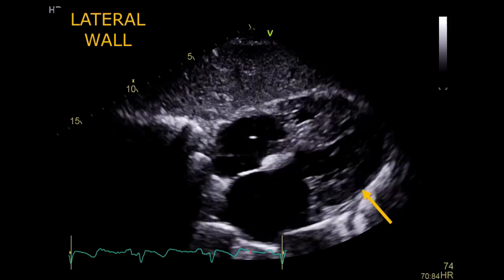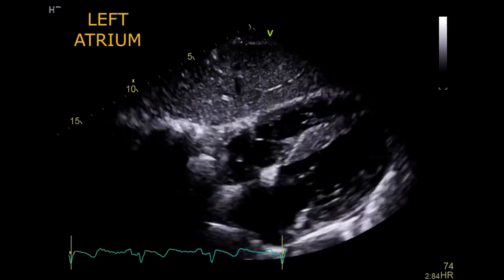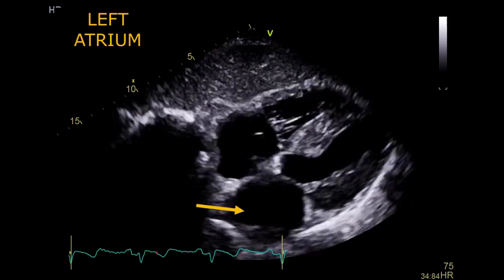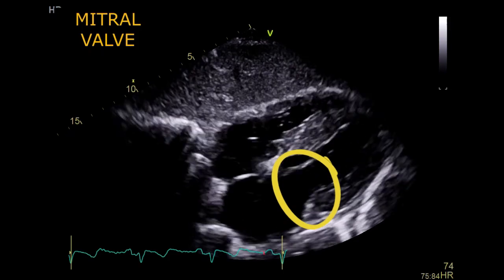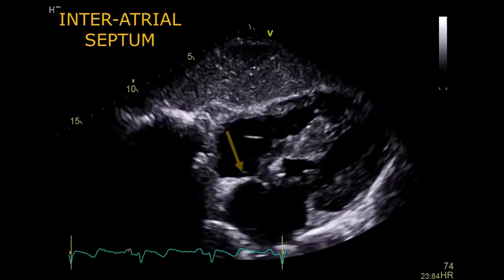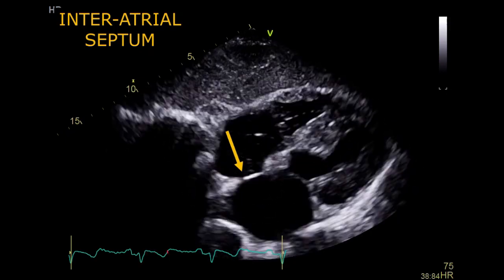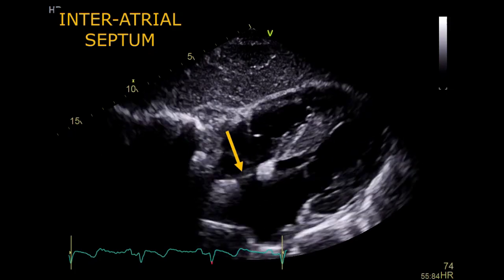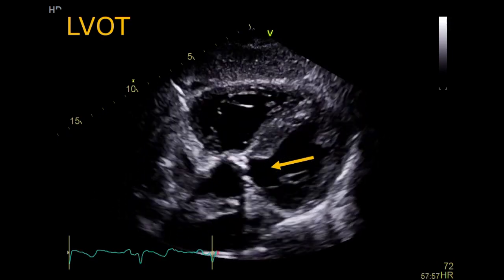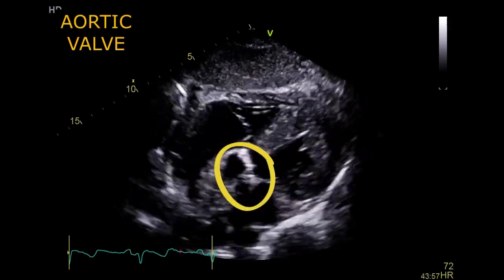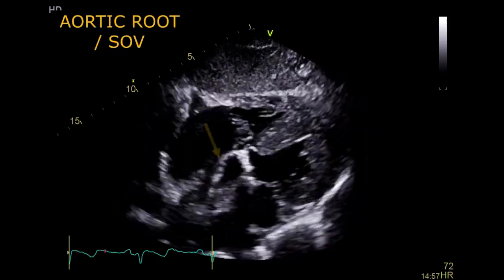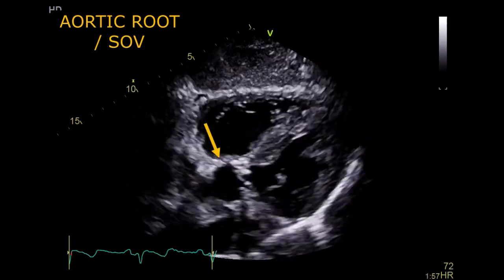Sometimes it's also possible to see the apex. To the left, that rounded chamber is the left atrium. Between the left atrium and the left ventricle you can see the mitral valve. This is a very good view to assess the inter-atrial septum — this wall between both atria. Now, if you tilt the probe a little bit and open the aorta, you can see the left ventricular outflow tract, the aortic valve, the aortic root or sinus of Valsalva, and sometimes part of the proximal ascending aorta.